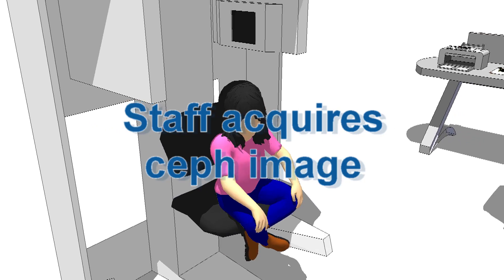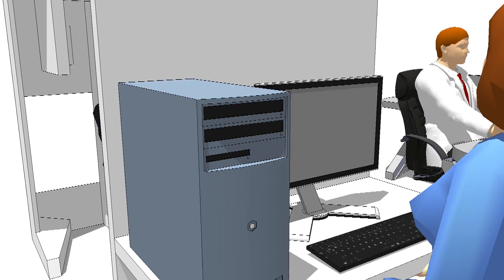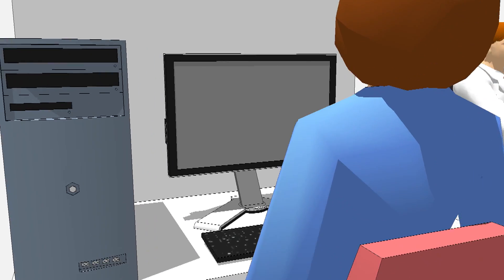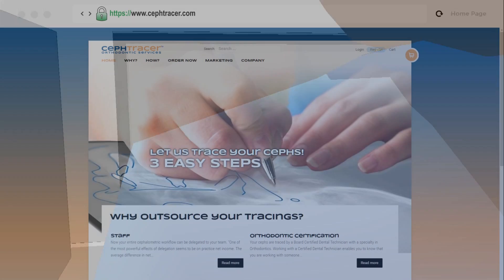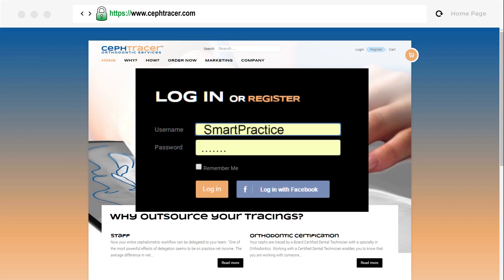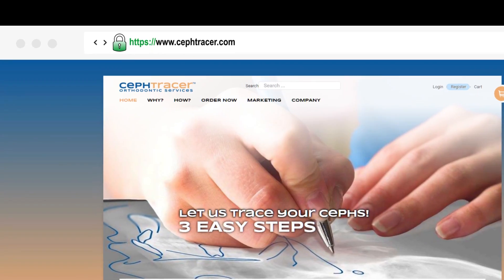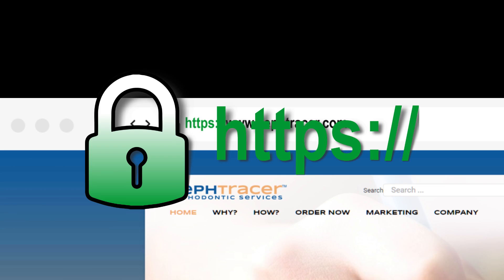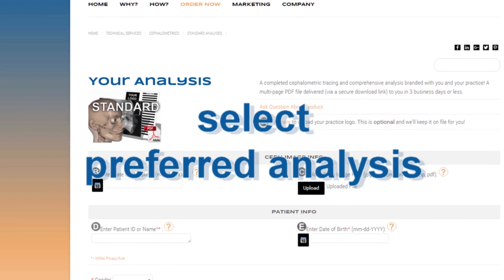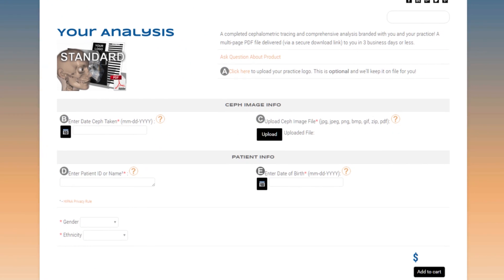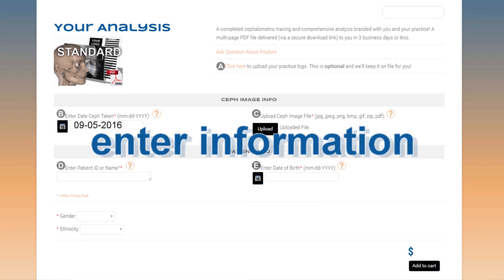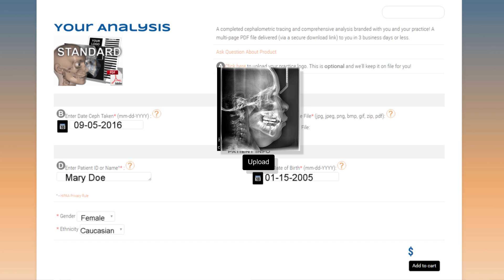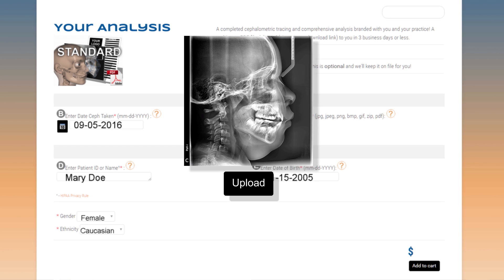Your staff acquires the patient CEF image as normal, then navigates to ceftracer.com and logs in through our industry-standard encrypted protocol. They then navigate to and select your preferred analysis, entering all of the required patient and CEF information and uploading the CEF image.